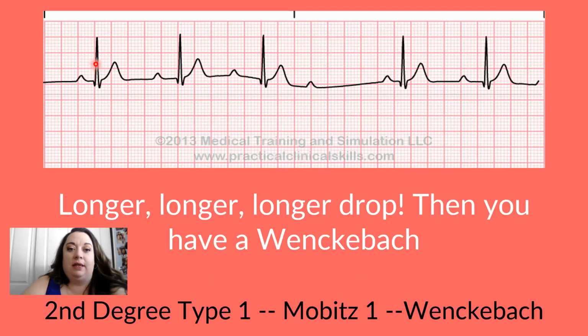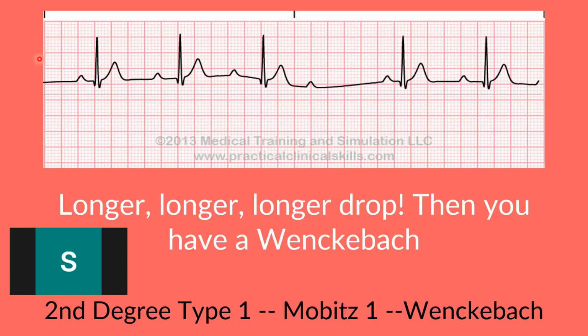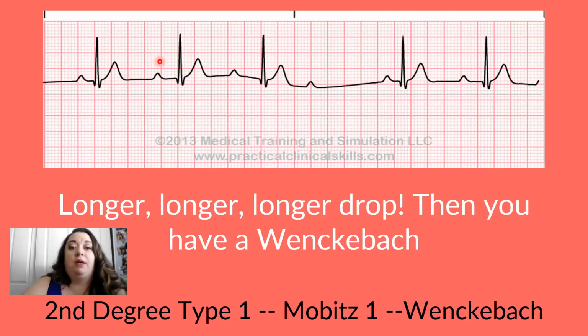So what you'll notice on this is my rate is 1, 2, 3, 4, 5. So this happens to be bradycardic, which is fine. I have one P wave for every one QRS. Let me know if you see that. No. This is why we check that. So P QRST, P QRST, P QRST, P, nothing. I have a dropped QRS, and then it starts over P QRST, P QRST. So what you're going to notice in this rhythm is you're going to have P waves that don't have a QRS associated with them because that whole beat got dropped.